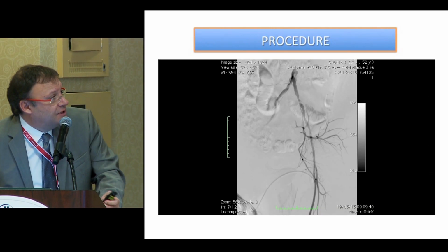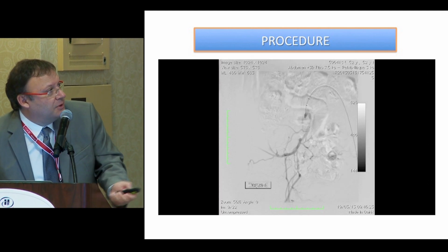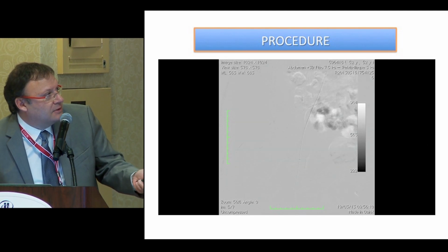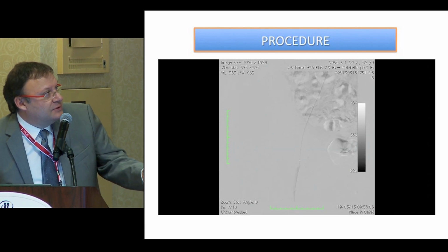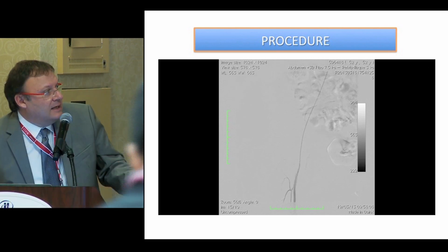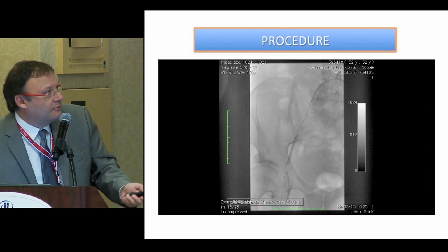And we proposed a procedure. On the angio, before, you have some lesion on the common and the external left iliac artery. We went to the stump, we had a little stump, and we passed through the occlusion with the guide, with the leader. We re-entered directly in the common femoral artery.